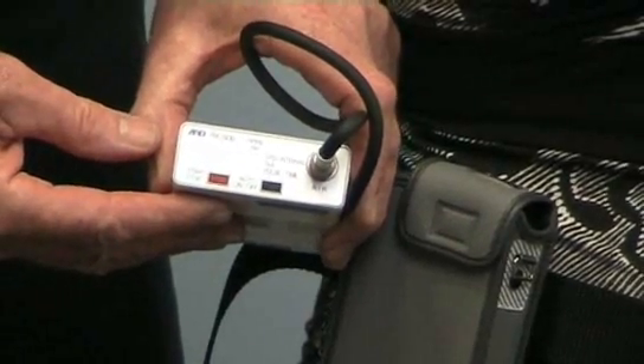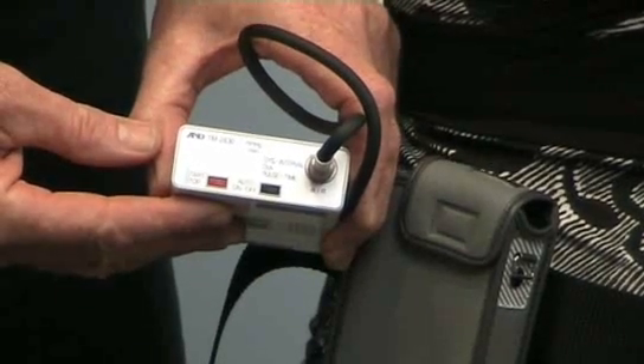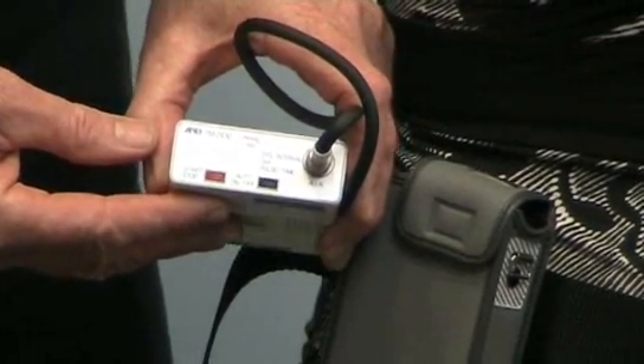We have preset this monitor to the British Hypertension Society guidelines — every 30 minutes during the day and once an hour at night.